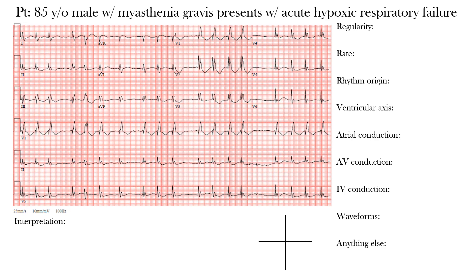Before we get started, let's review the approach we've been using to interpret EKGs. We have the patient's clinical presentation and the EKG below. On the right side of the screen you'll find a list that we'll go through before making our final interpretation. First, we'll look at the regularity of the rhythm — are we dealing with a regular or irregular rhythm, and if irregular, is it regularly irregular or irregularly irregular? Next, we look at the heart rate.